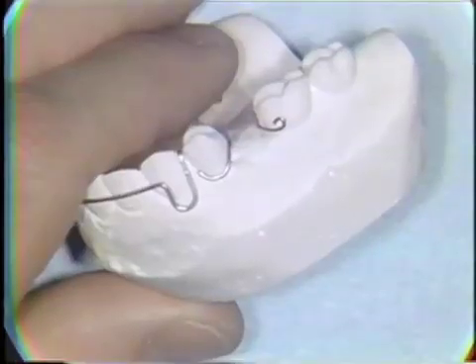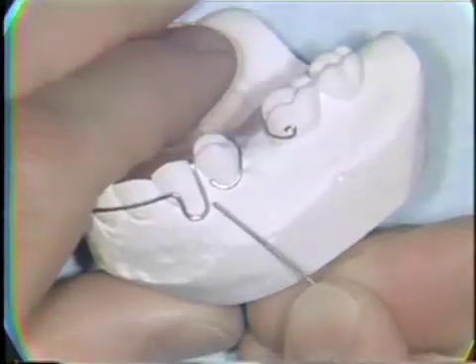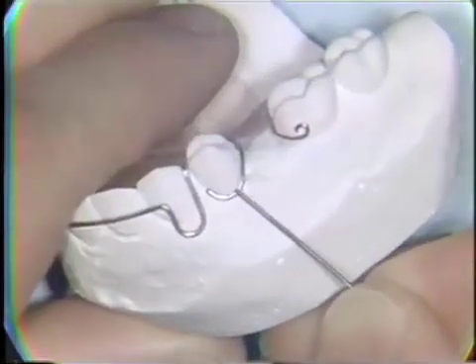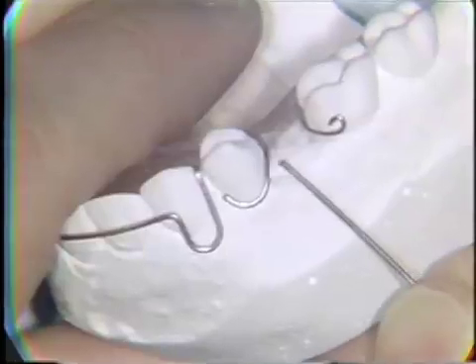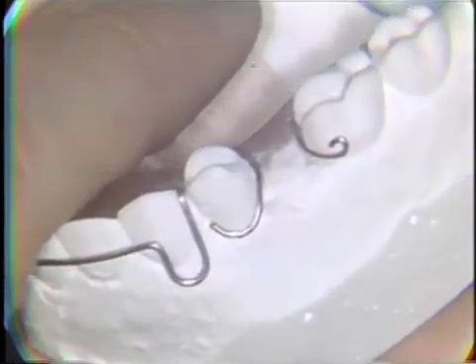The circumferential clasp gains its retention from engagement of the undercut area, from the gingival to the buccal bulge of a posterior tooth. The wire contacts the tooth just occlusal to the free gingival margin, and it continues and extends into the palatal acrylic to be about one millimeter off the tissue.